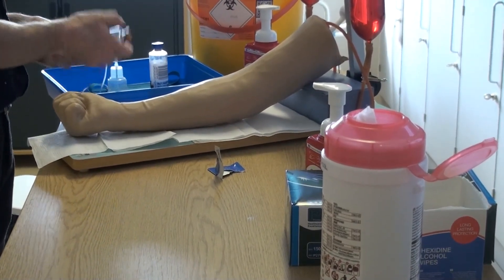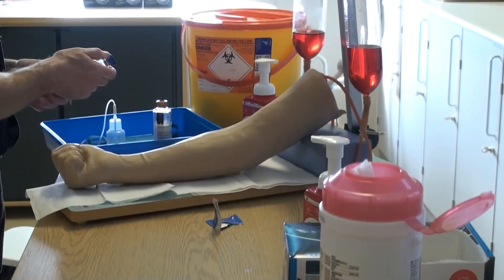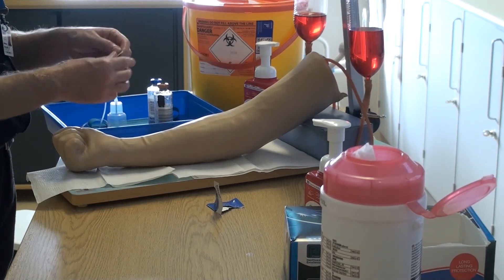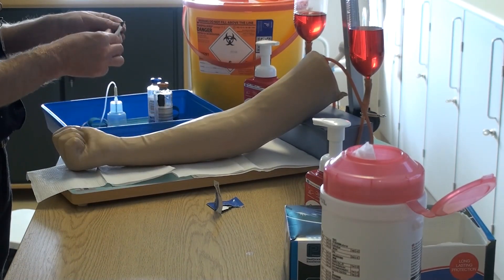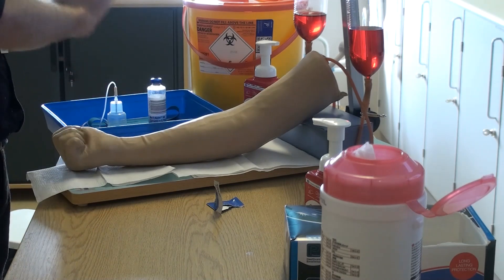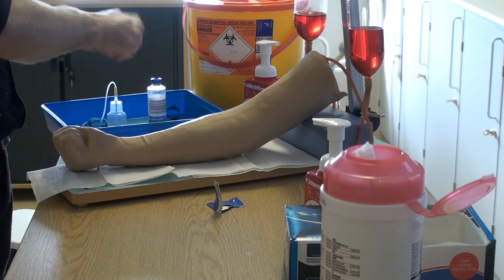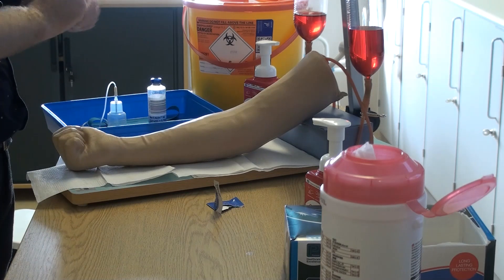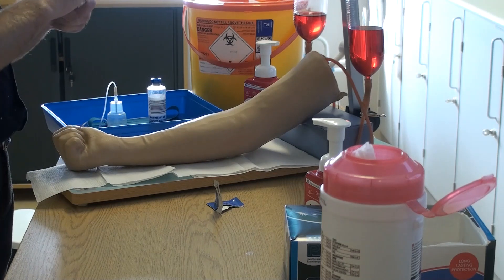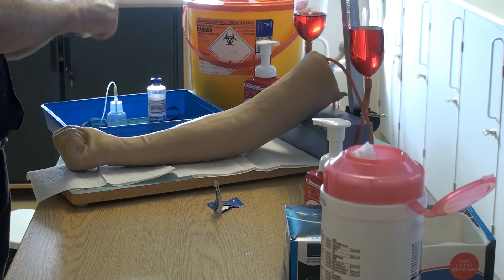While the skin dries, remove the caps from the blood culture bottles. Now using an individual green clinel wipe, clean the tops of the bottles using all four corners of the wipe, ensuring that the shoulders of the bottles are covered also. This removes any dust or debris and helps prevent any cross-contamination of the bottles. Each bottle should be cleaned for 30 seconds and allowed to dry.